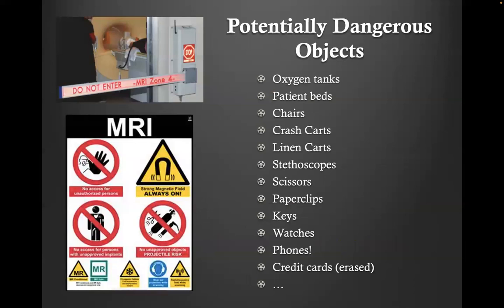My advice is just don't bring anything. Make sure that your pockets are empty, you don't have anything on you. Other than that, the keys, watches, phones, credit cards are not going to fly, but they are going to be erased.